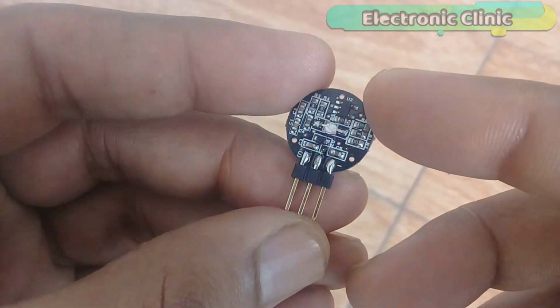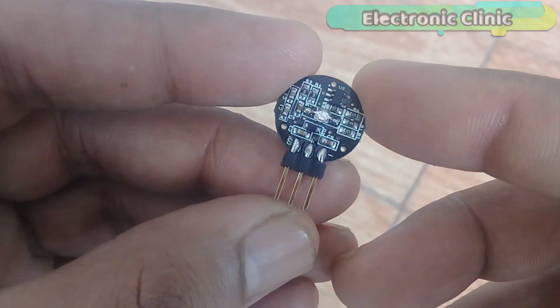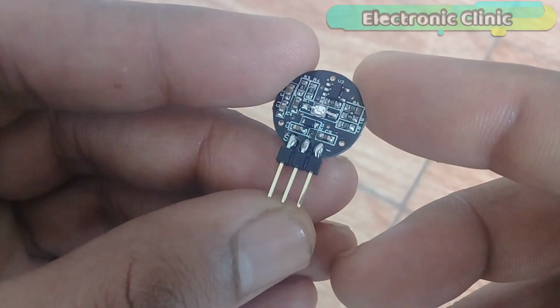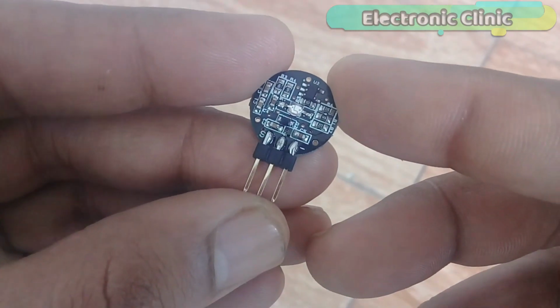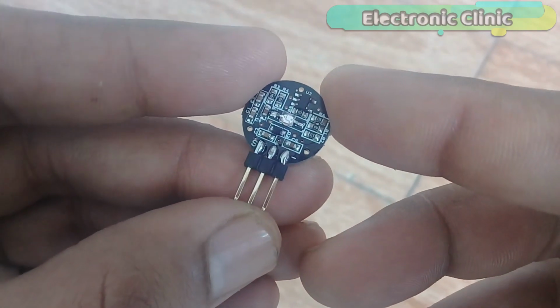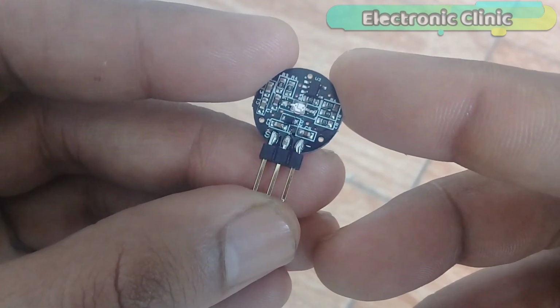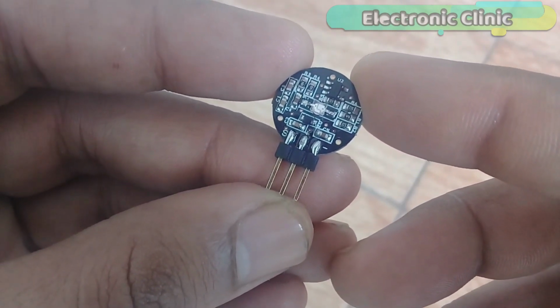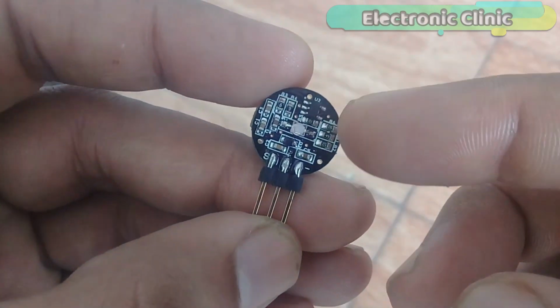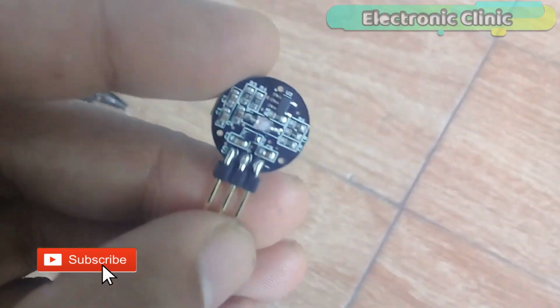As you can see, this pulse sensor has three male headers, which are labeled S, plus and minus. S is the signal pin and will be connected with the analog pin of the Arduino. Plus pin, which is the middle pin, is the VCC pin, and this pin will be connected with the Arduino's 3.3 or 5 volts. While the minus pin is the ground pin, and this pin will be connected with the Arduino's ground.